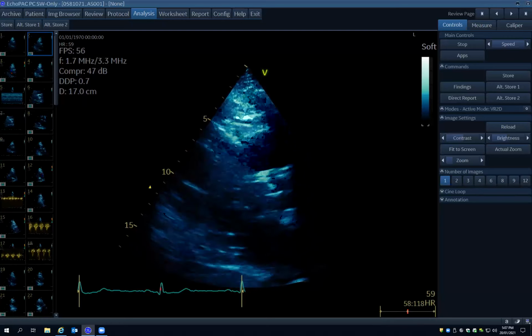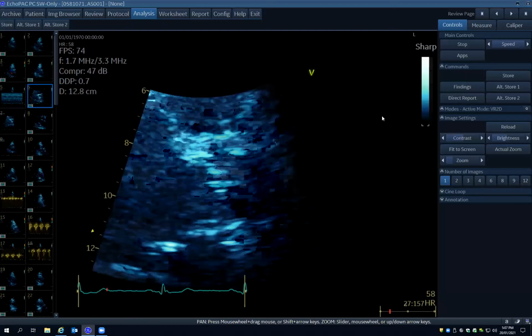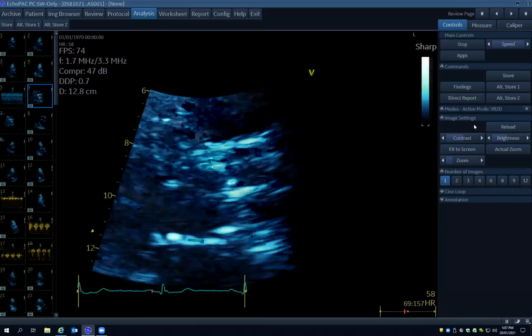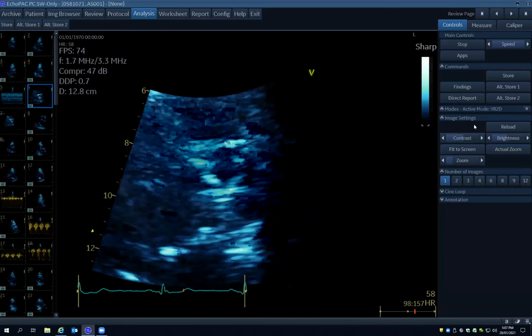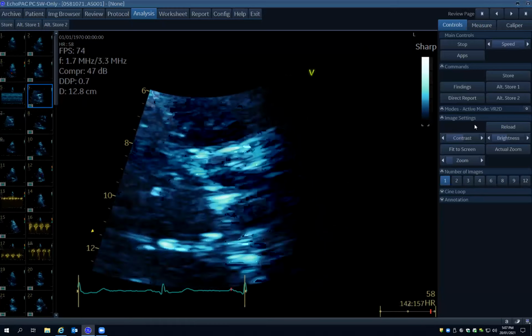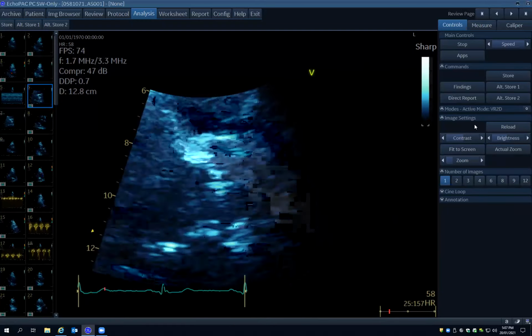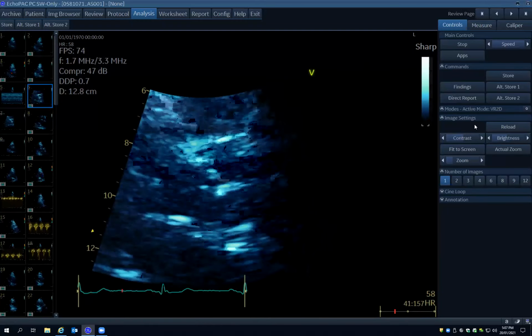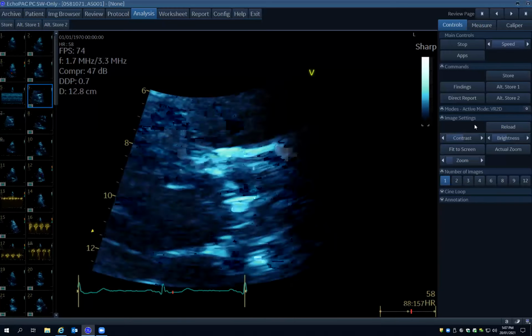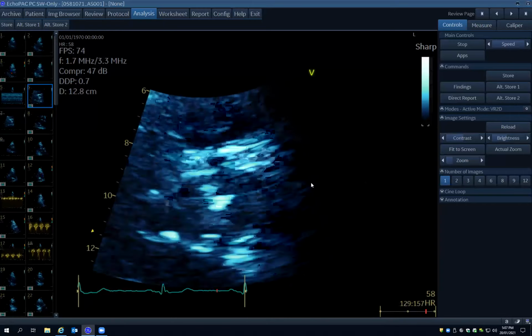Awesome. So let's keep going. Should we just try? Give us the zoomed in view of the aortic valve, because obviously that was, as you said, what we were worried about. So this is a good zoom view, and this is exactly what you want to do for specific reasons. One is to calculate an LVOT diameter, given that you're going to be squaring this measurement to estimate your LVOT area. And here we can see, again, a thickened calcified aortic valve with minimal leaflet excursion. Calculating the diameter may be challenging here with the degree of calcification.